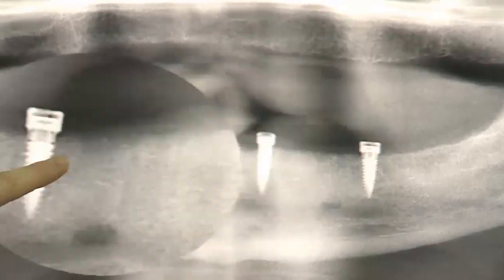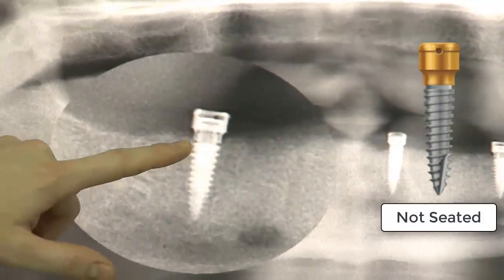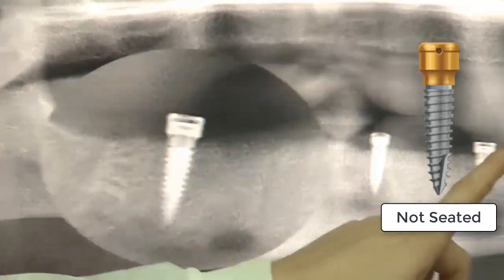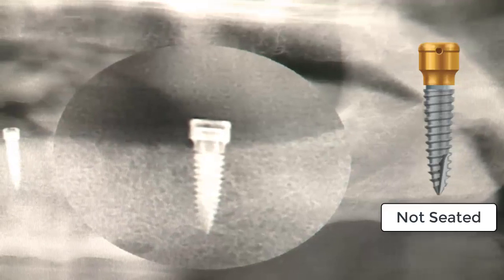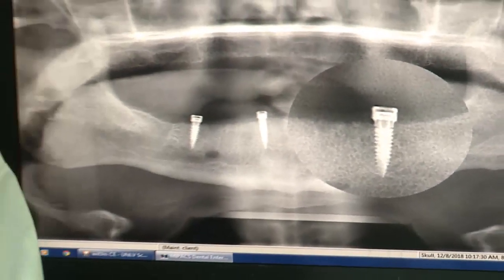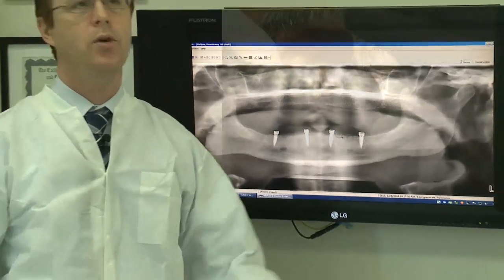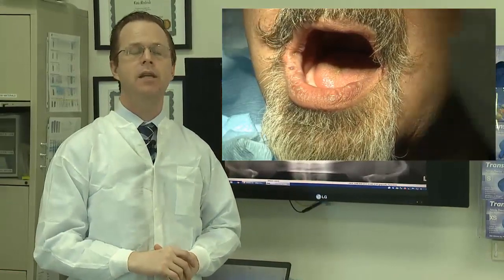As we move over to number 30, you can see there's a little bit of a tiny gap between the edge of the platform and the abutment. And traversing over to 19 as well, there's a similar type of gap, just a little bit smaller. Long story short, we looked at it and said number 19 and number 30 still need to come down a little bit.